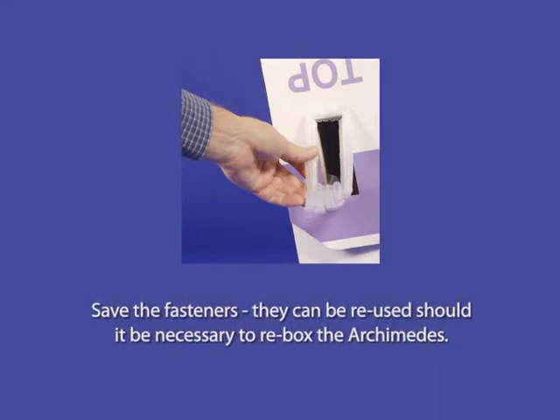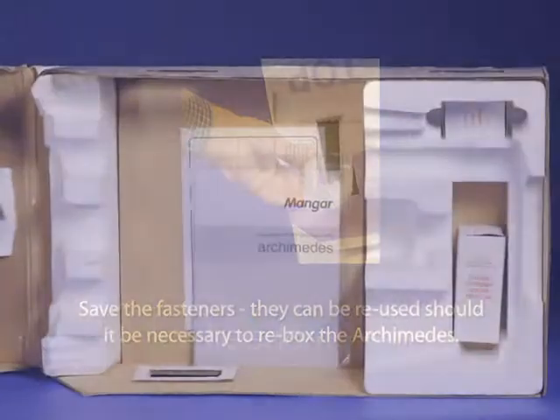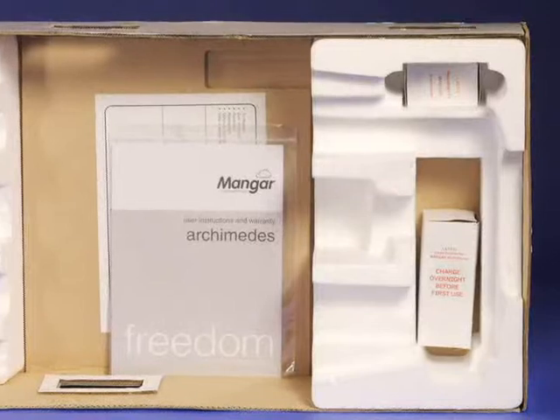Please save these fasteners — they can be reused should it be necessary to re-box the Archimedes. Locate the user manual, hand control, and battery charger inside the box.